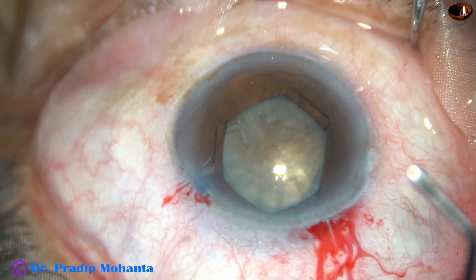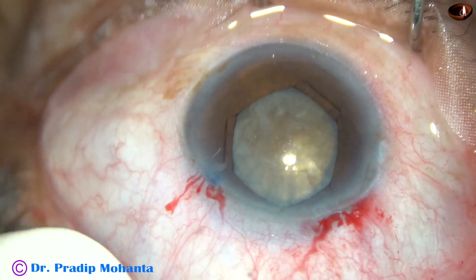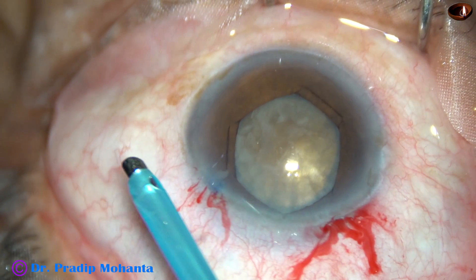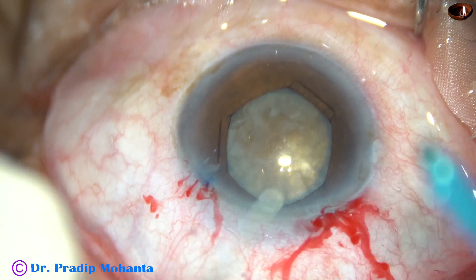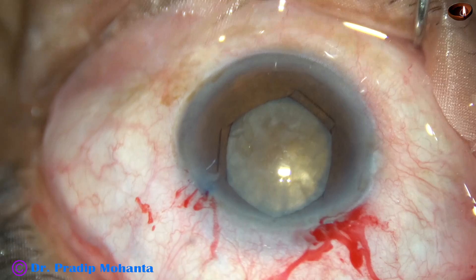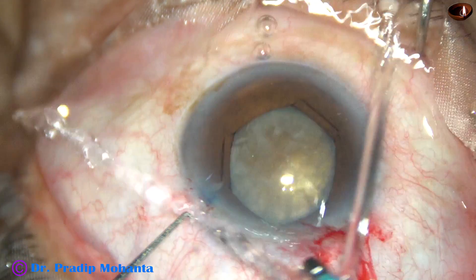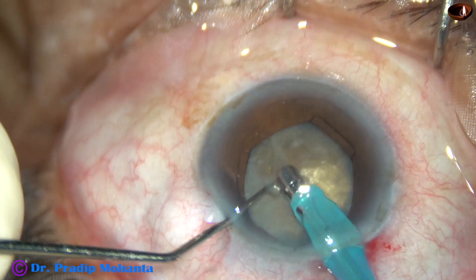And now, after injecting visco, the tip of the phaco needle is to be introduced. See the exposure of the tip — I am going to rotate the sleeve and expose the tip a little more so that I can deliver more ultrasonic energy into the substance of the nucleus.